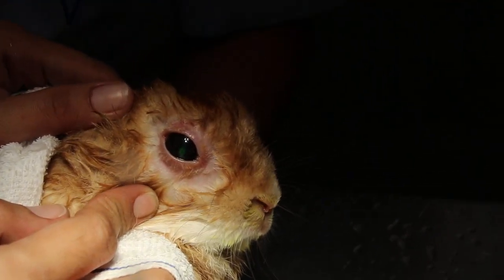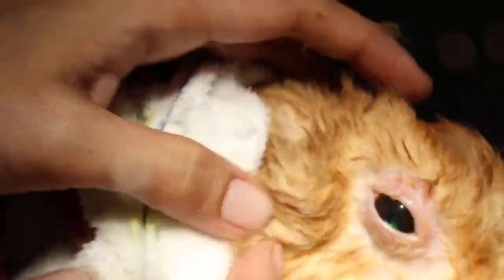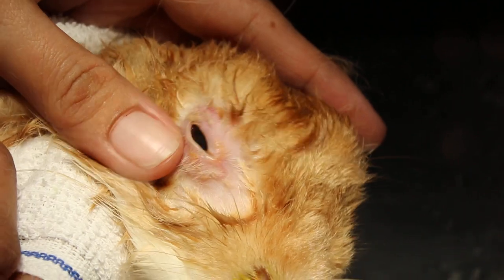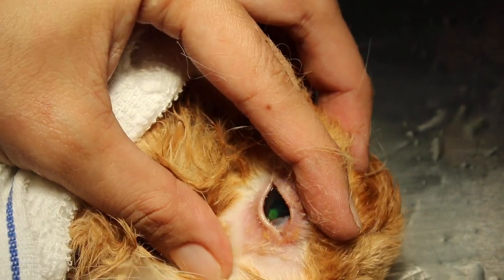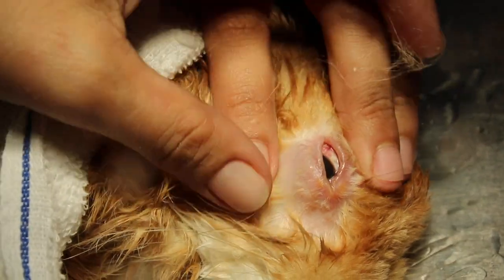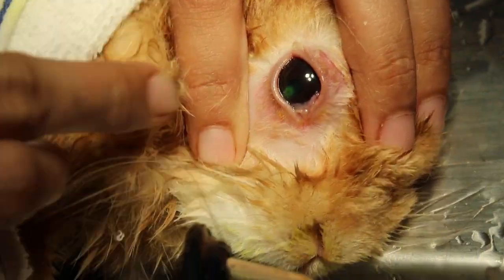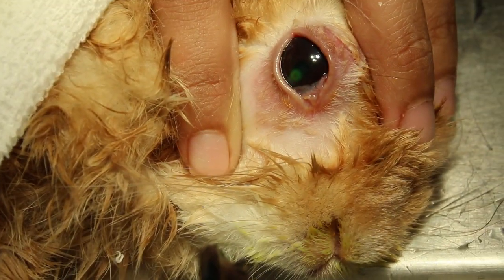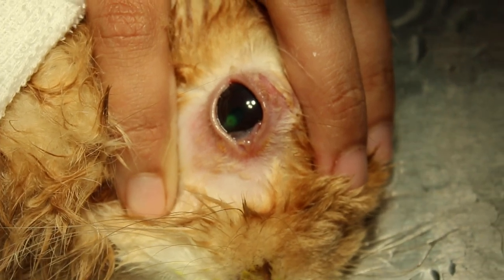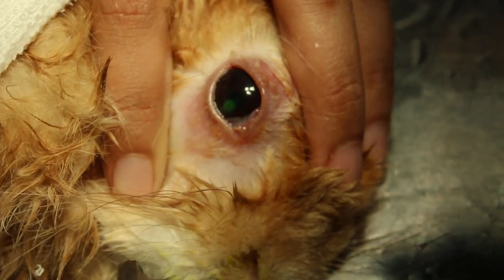Towards the light. Let me focus. Let's see the ulcer again. How many millimetres is it? What position? It's at five o'clock — not in the centre, it's below the centre. This is hard to see. The centre is the pupil there — you see the pupil. We nearly missed it. Now there's one hair there — take out the hair.